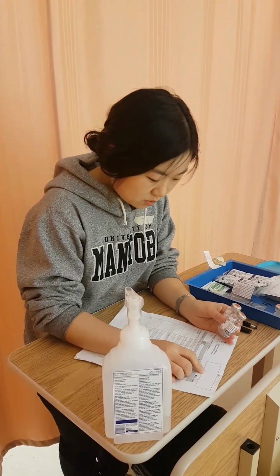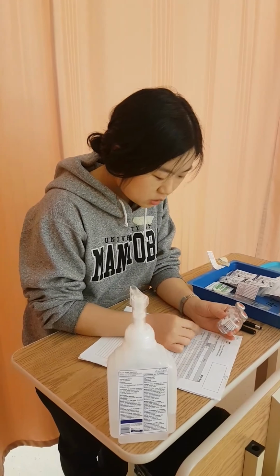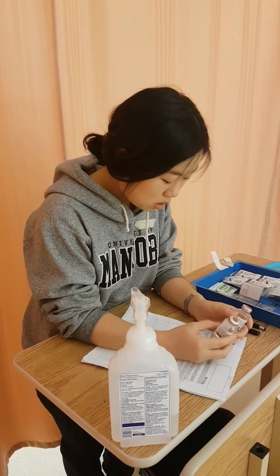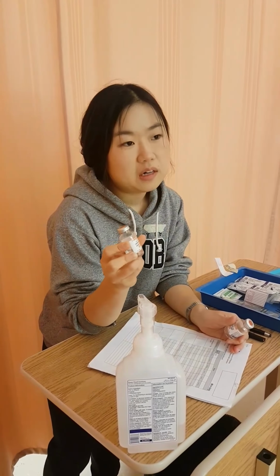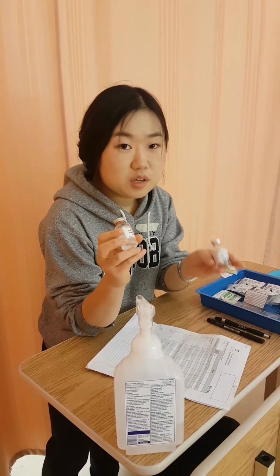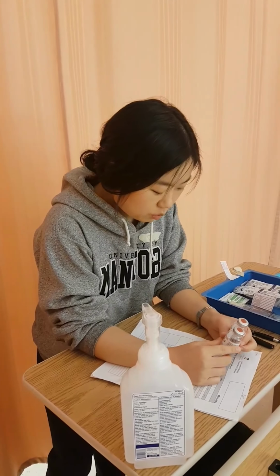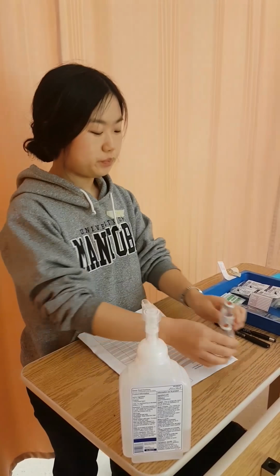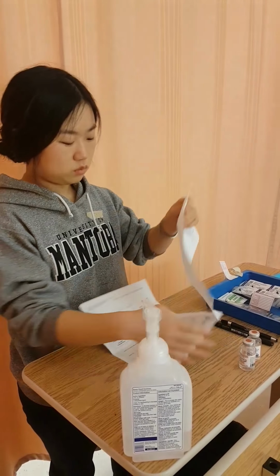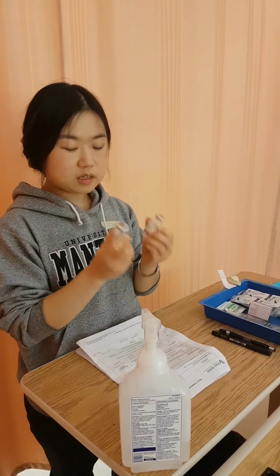This is for John Smith, who has no known allergies. The drug name is Ceftriaxone. This is also Ceftriaxone. The dose is 1.5 grams, and because one vial has 1 gram, I grabbed another 1 gram vial because I need more. The route is through IV, and the time is every 24 hours, and it is due now. Also, I'm looking at the expiry date, and it hasn't expired.